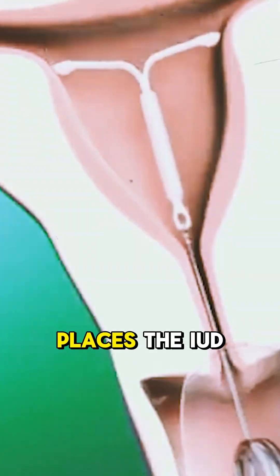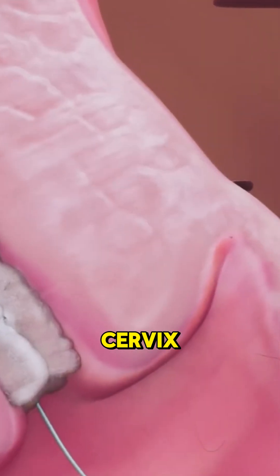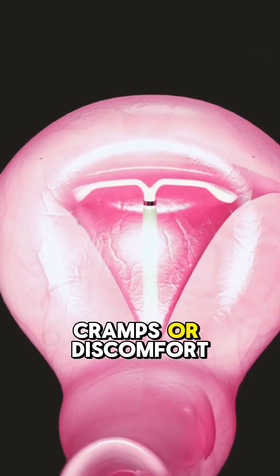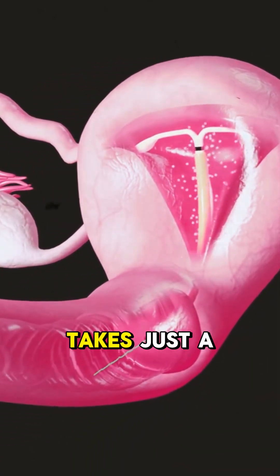Next, a thin inserter places the IUD carefully through the cervix into the uterus. You might feel cramps or discomfort, but it usually takes just a few minutes.